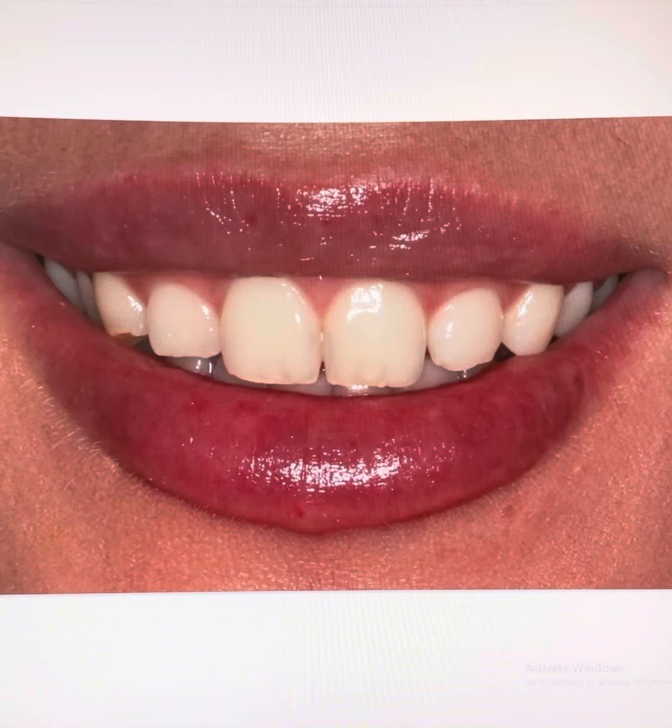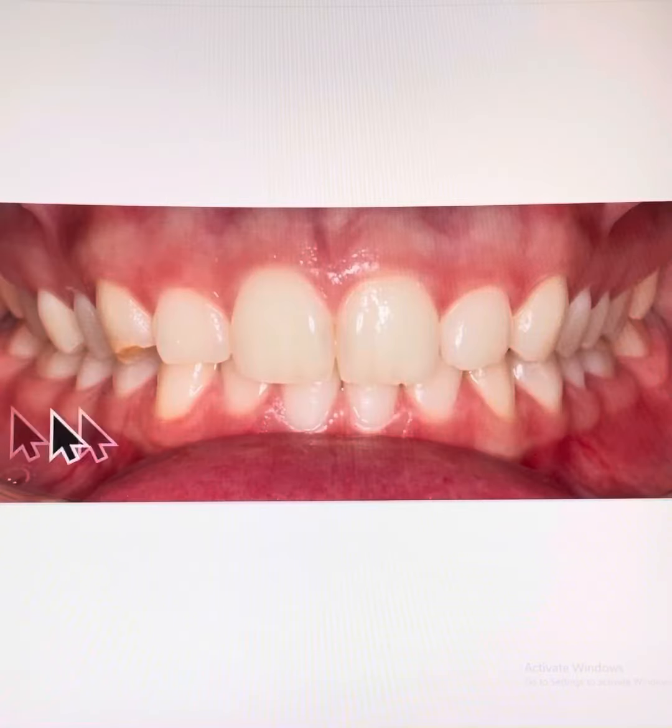Young patient in her 20s wanting whiter teeth and a better smile curve along the edges of her upper front teeth. She does not like the difference in height between the two front teeth and the front side teeth, and she doesn't like the translucency on her front teeth. Also, her right-hand side canine has chipped significantly due to some previous teeth grinding.